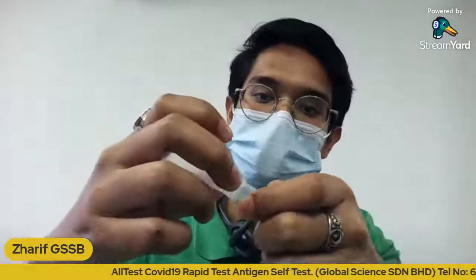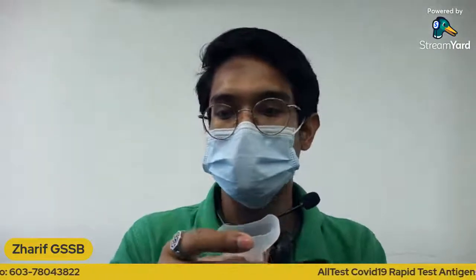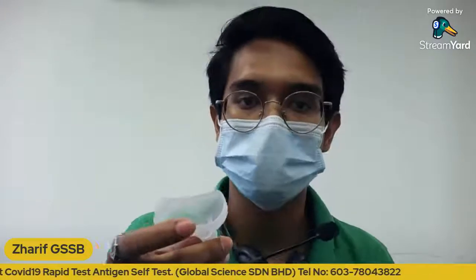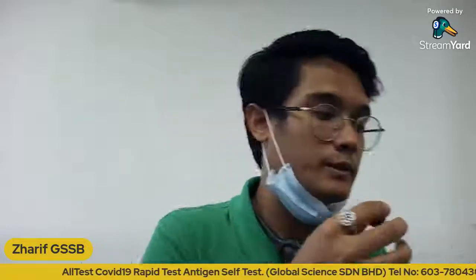Alright, the first step is to attach the funnel to the tube, and all you need to do is just press it in, like so, like that. Before you extract your sample, make sure to deeply cough around 3 to 5 times. And if you produce phlegm when you deeply cough, make sure to dispose of the phlegm first before you spit in. I'm going to show you an example of how to deeply cough, like so, and then you just extract the sample.